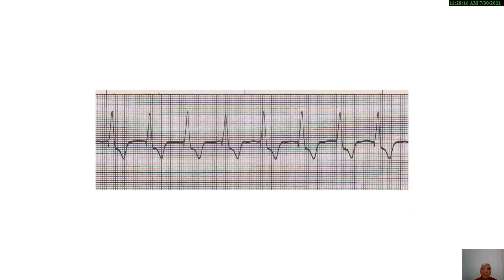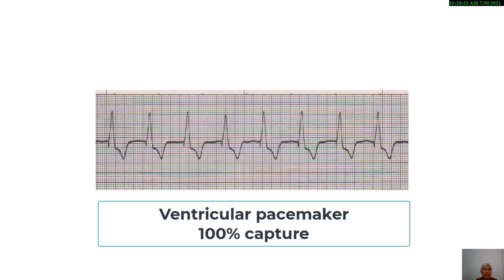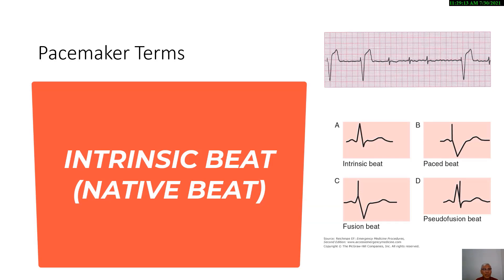In this example of a ventricular pacemaker, each pacing spike is followed by a QRS complex. Each spike was successful in producing a depolarization wave as manifested by the QRS complex, illustrating a fully functioning pacemaker with 100% capture — meaning the electrical stimuli produced by the pacemaker successfully caused a wave of depolarization.